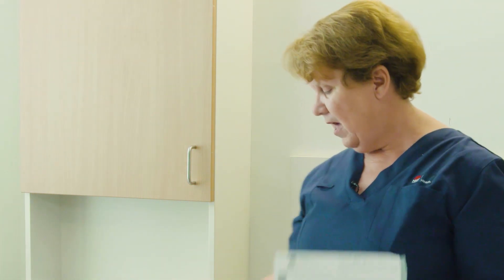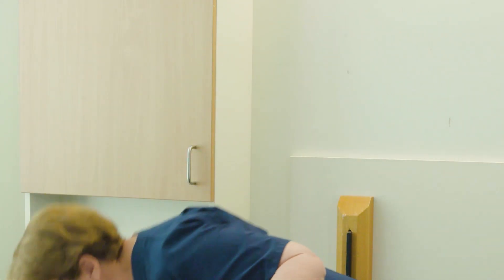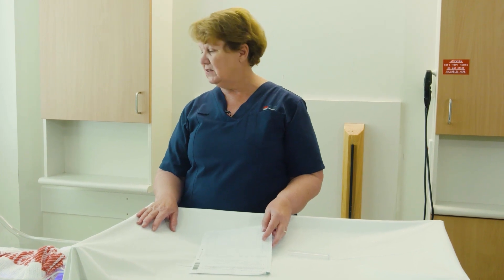Troubles that may happen during the time: if the power didn't work, simply check the back of the machine to make sure the plug is securely in and on the wall. If the baby got cold, warm up the environment and give the baby a feed — but if you're not happy, ring the midwife. If the baby is too hot, cool the baby down, give a feed, and check the temperature in an hour's time. If it's still above 37.4, speak to the midwife.